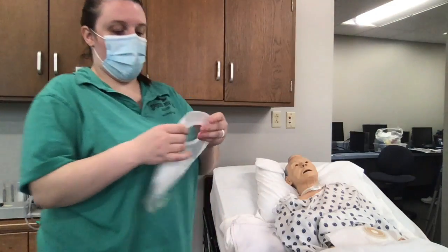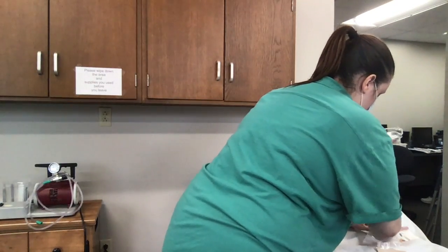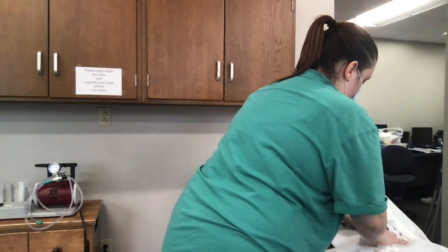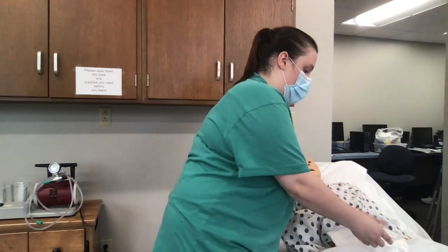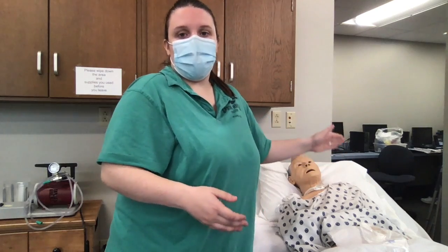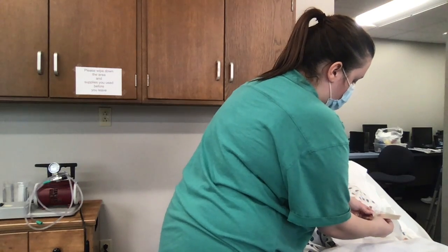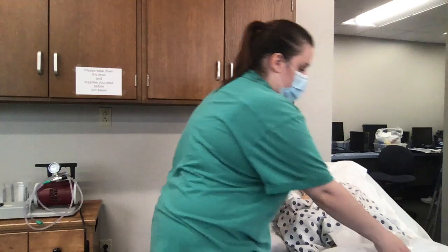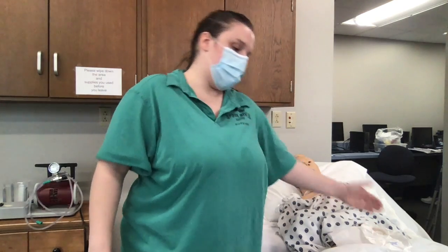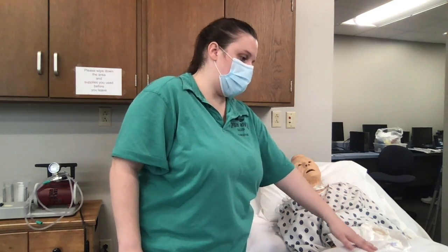And then I'm going to obtain my bag, and I'm going to place this. Just snaps right on, not pushing too hard on my patient. And I want to make sure that one of these clips is on here, or else my feces is just going to drain right out of the bag. It's going to make a big mess. So I want to make sure that my clip is on properly. Okay, good and tight. And then I want to make sure that my bag, when placed, is pointed toward the feet of the patient, so that way it is draining properly.